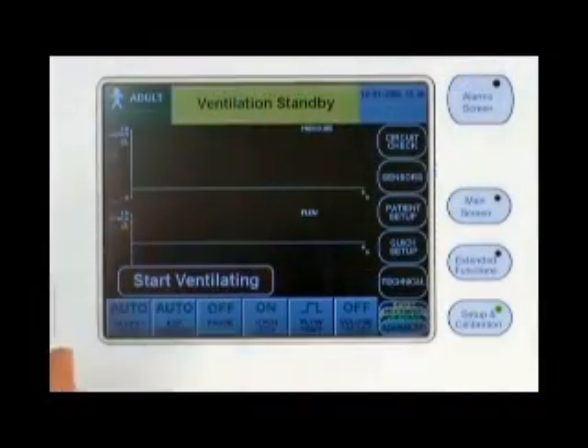The graphical user interface contains the advanced ventilation settings, alarm settings, ventilator setup settings, and monitor data.